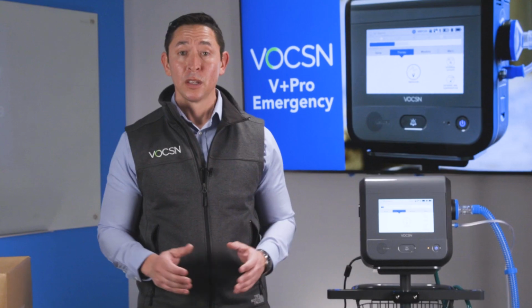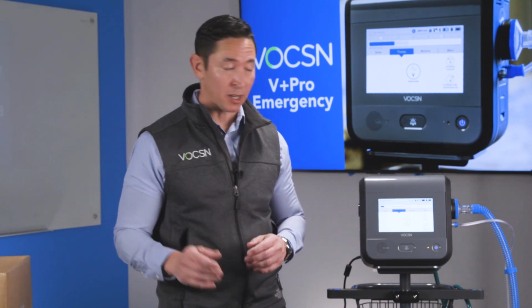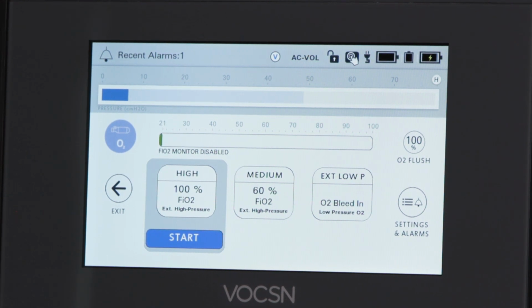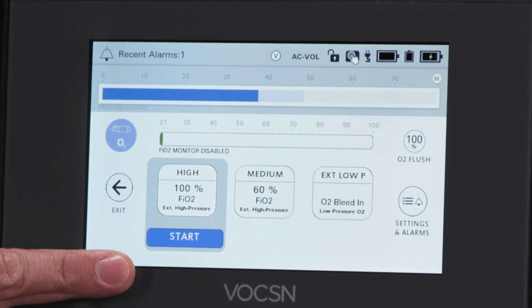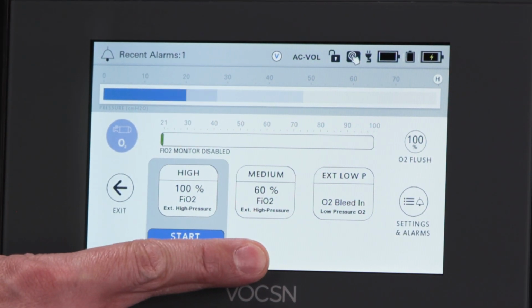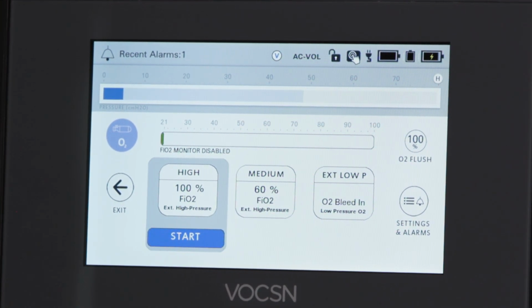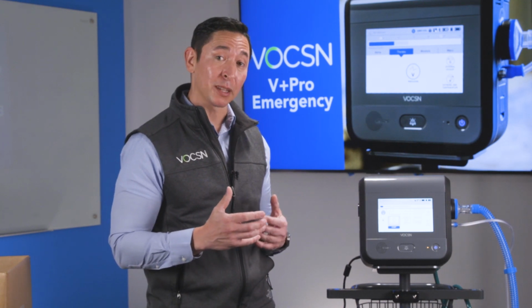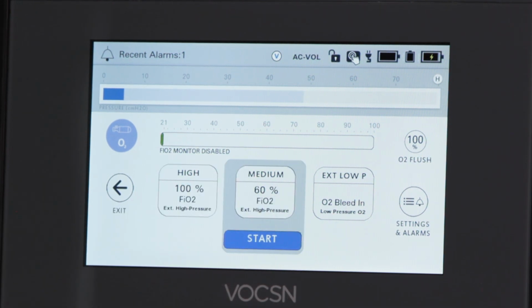So if you want to provide oxygen to your patient, all I need to do is touch the oxygen icon, which is just right there. So VOCSN V+Pro Emergency comes preset with oxygen settings. You have one set at 100% FiO2, another one set at 60% FiO2, and then the third preset is set to bleed in low pressure O2. So if I want to engage one of these presets, I simply highlight the preset I would like and just hit start. So maybe I'll touch the medium and I'll just hit start.